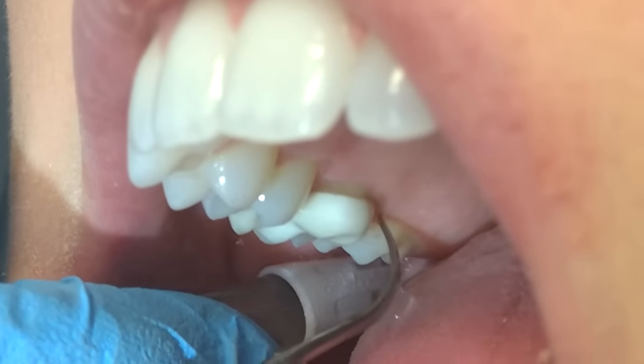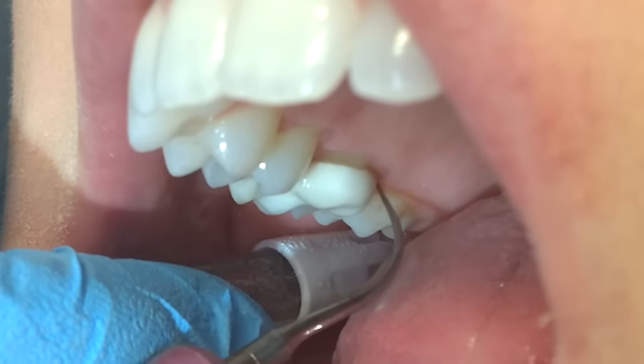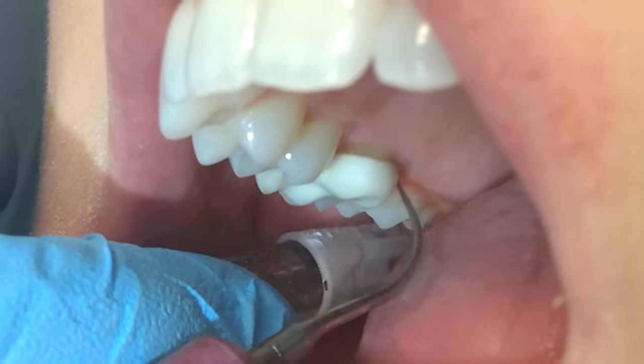Adapt around the crown margin just like you would a non-restored tooth. With the power scaler, use a probe-like stroke all the way around the margin, making sure that the tip is always in contact with the tooth surface for comfort.